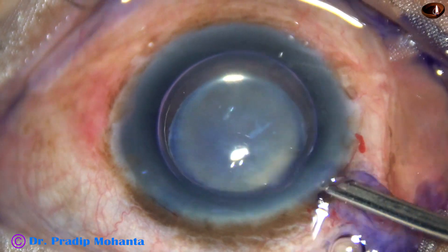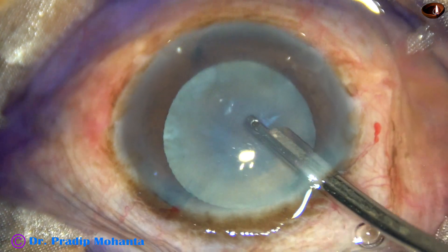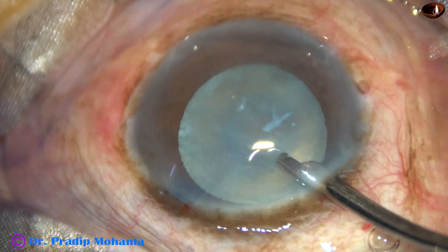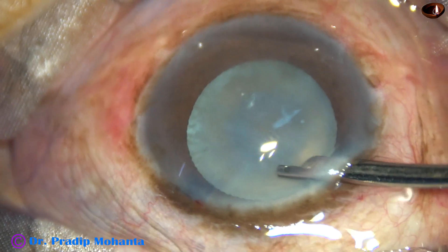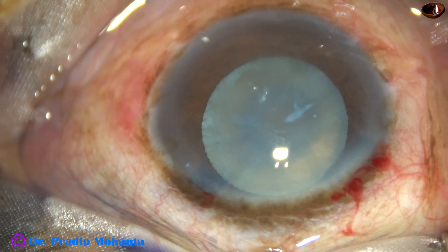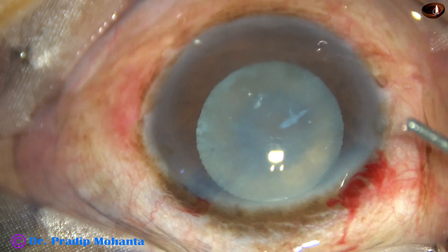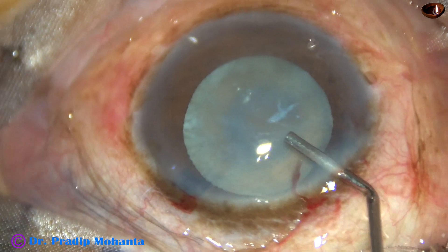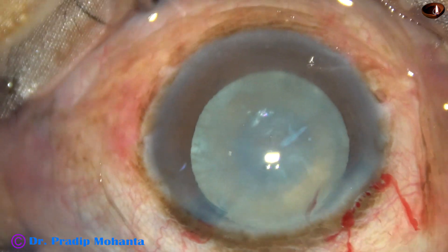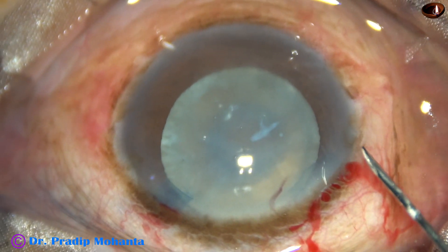The dye is washed out with BSS. This cataract is hypermature, but at this time it is neither intumescent nor is there any milky fluid. So it can be called a hypermature sclerotic cataract. Probably the cataract was intumescent a few months back, the fluid has since absorbed, and now the cataract has become sclerotic.